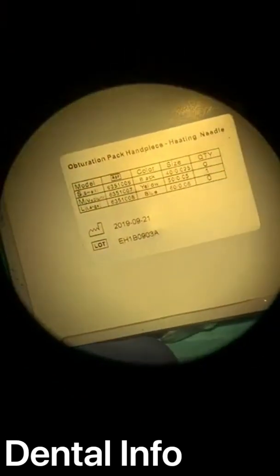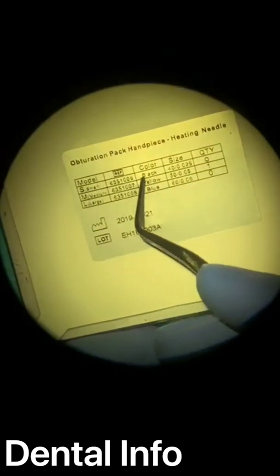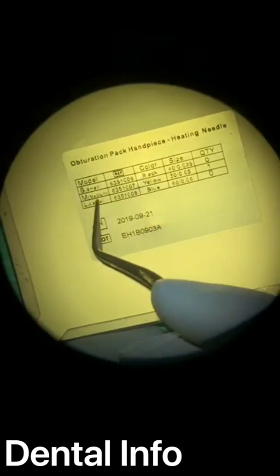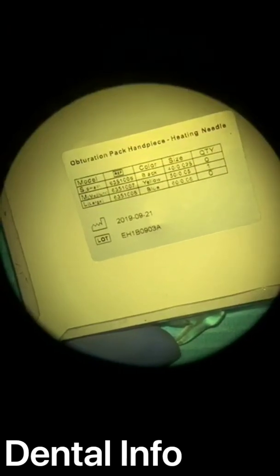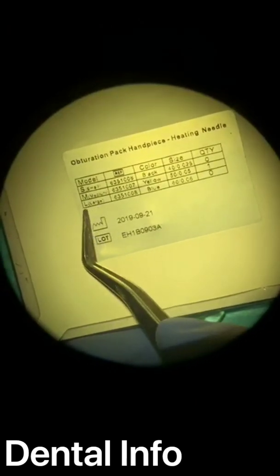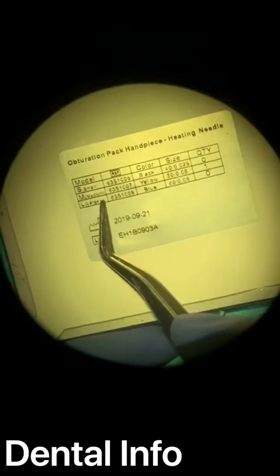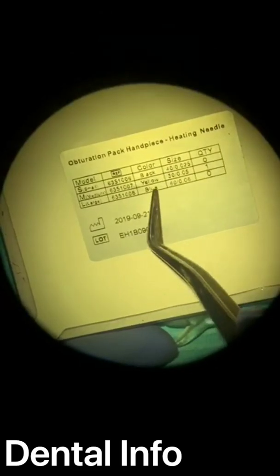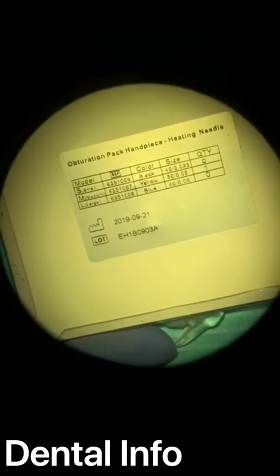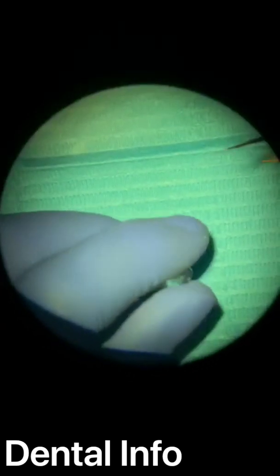because 8 teeth, they have 3 sizes here, as we can see. They have a small one with black color, they have medium one with yellow color like this one, and they have a blue one, it's the large one with 60. The tip size is 60, the medium, the tip is 50, small, the tip is 40. So you have to make fitting for your tip as much as you're making fitting for your cone.